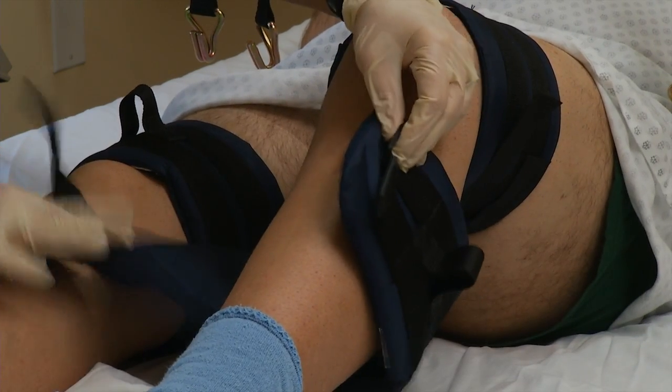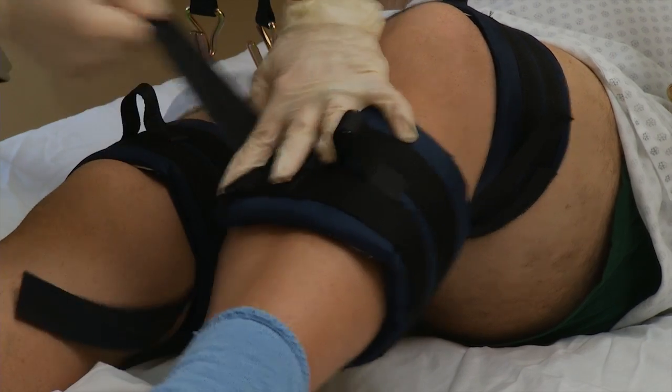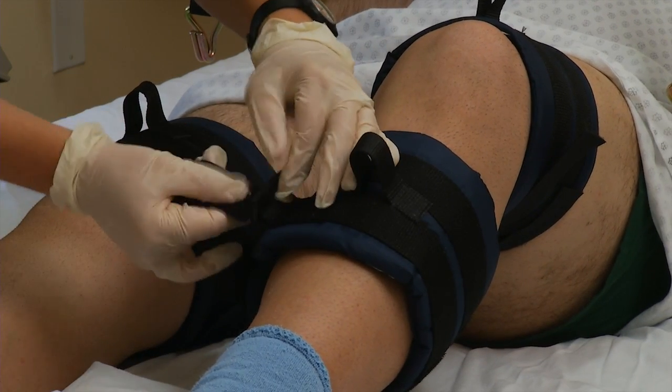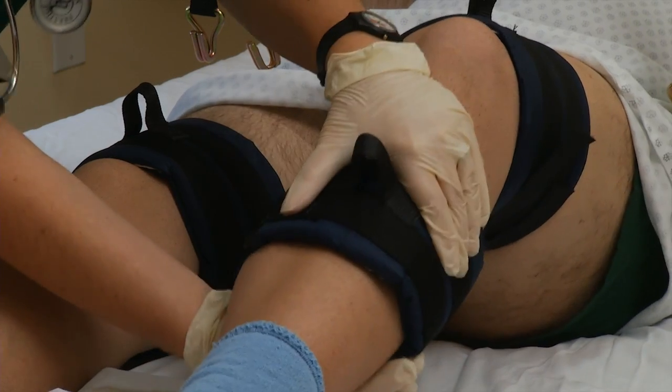In this case, we will be using our straps with Velcro fasteners. The Laven LiftStrap comes in various sizes in order to ensure a secure fit. The secure fit around the leg is necessary in order to avoid slippage when lifting the patient.